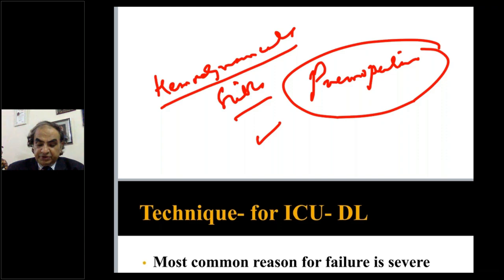See, the other problem with the patient under local anesthesia is he's breathing. So the diaphragm also causes a rise in the intra-abdominal pressure. And then you also raise the pressure, so you'll have respiratory embarrassment. Besides pain, which will produce tachycardia, tachypnea as it is. So you know when a person is breathing, there is an increased intra-abdominal pressure with each breath. And you also raise pressure in the abdomen. This may cause trouble. Therefore, general anesthesia is better.